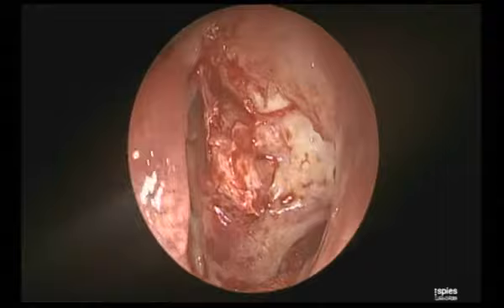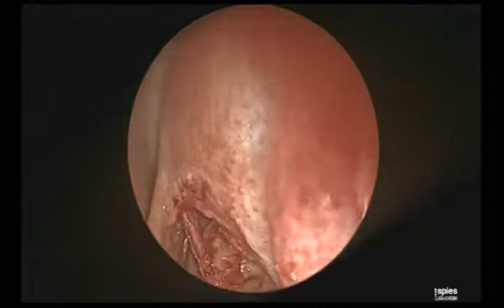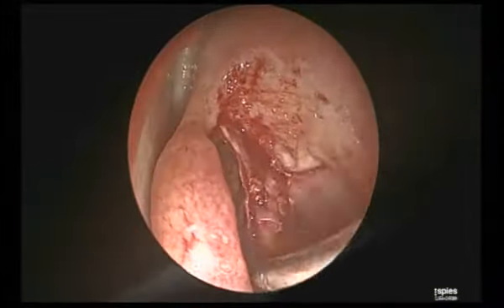Are you getting what I'm trying to say? Yes, yes. So now the surgical landmark, actually, it's the middle turbinate that is guiding you.